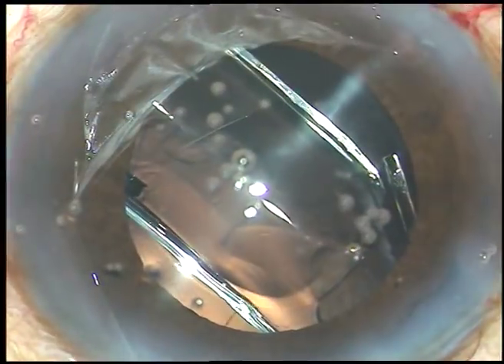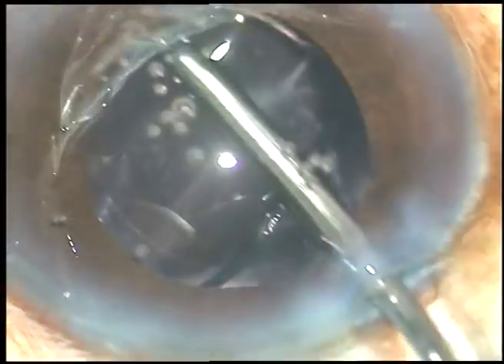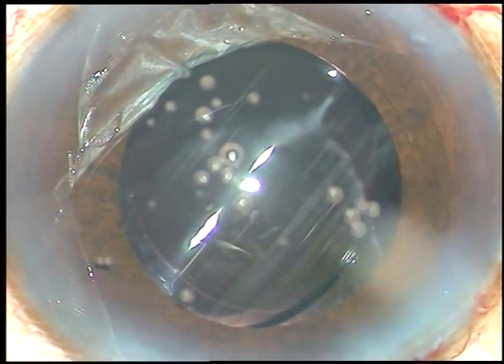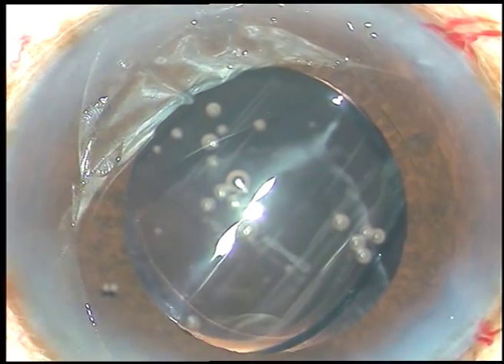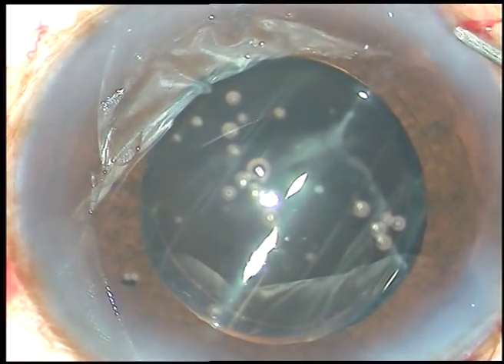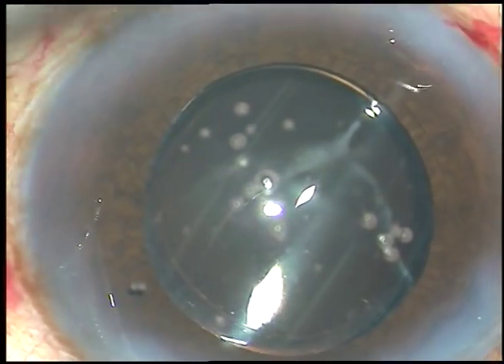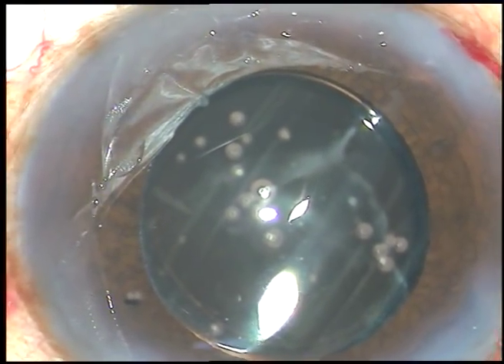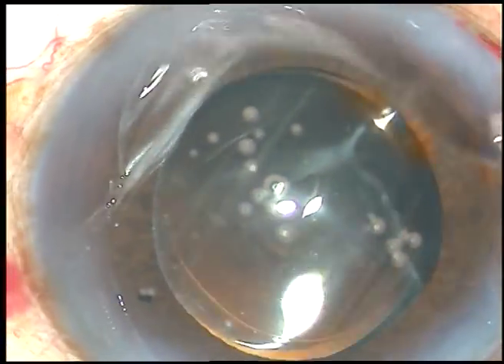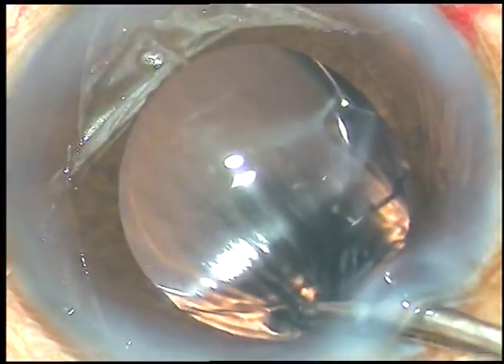This lens is a superphobic lens from Appasamy Associates — a very nice lens that opens gradually. And now, a little bit of moxifloxacin is injected into the anterior chamber. The side ports are hydrated. The stroma on either side of these stab incisions is hydrated and the stab incisions become watertight — water cannot leak out.